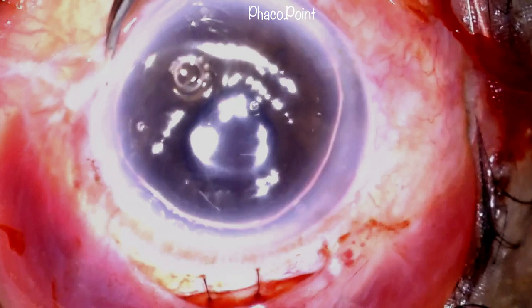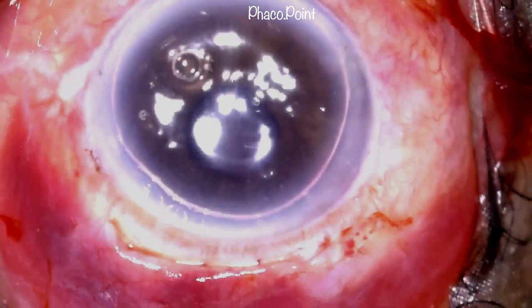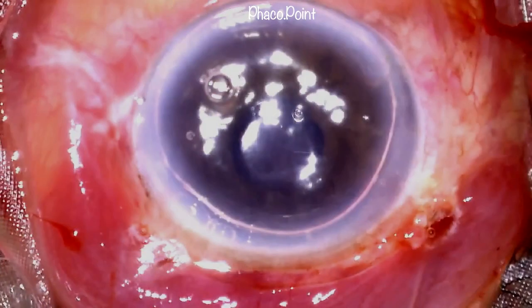The scleral tunnel is now sutured, the sutures are then buried, and this is followed by the conjunctival closure with the help of cautery. And at the end, this is the end result that we achieved. An anterior chamber free of vitreous, a nice small round pupil, and a stable IOL in the ciliary sulcus.